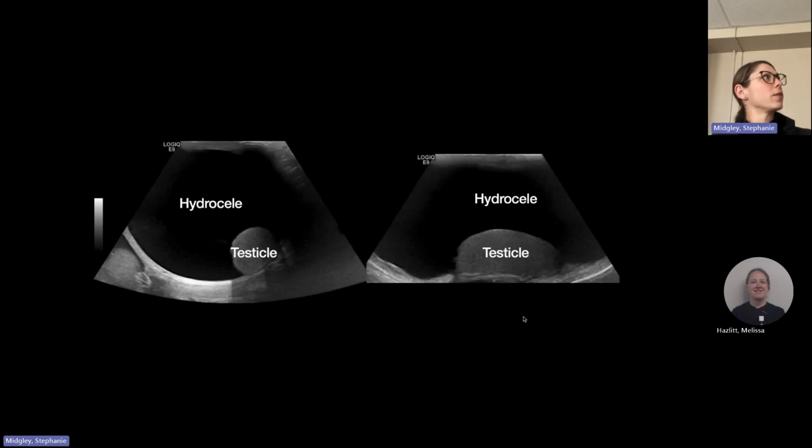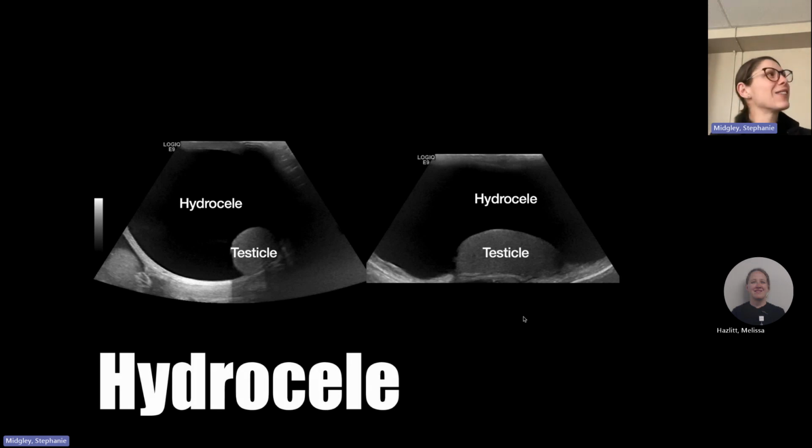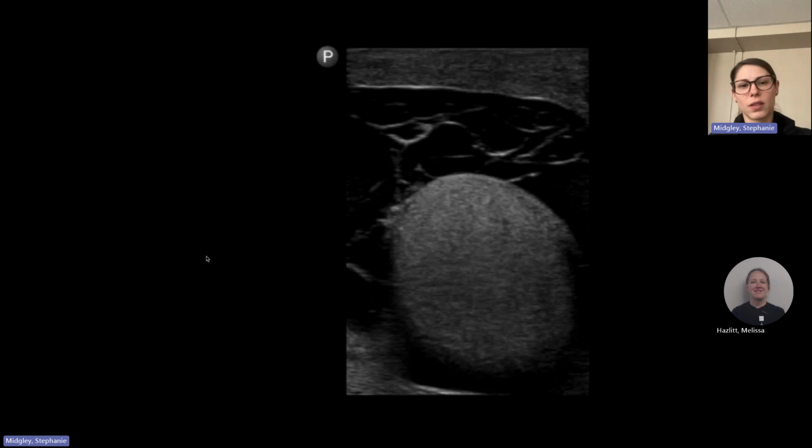All right. What do we have here? Oh, just kidding. It's right there. Hydroceles. Yay. I like giving the answer. So things to look for, right? Posterior acoustic enhancement. You're going to see the fluid collection between the two layers, the tunica vaginalis. And then it's the most common reported cause of painless scrotal swelling. So compare this one to what this one is.